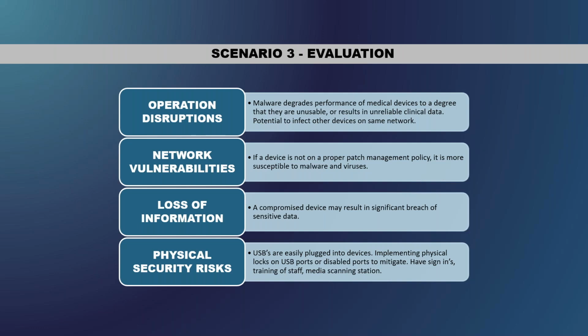So you also want to make sure that you have vendor check-ins in place, making sure that anybody who has access to it, also who's accessing all the medical equipment in your healthcare environment. And then also implementing those media scanning stations. Yep. So having those stations available in Biomed or in the records department, with antivirus scanning software that you can unplug from the network and it's still able to be used, and then scanning those devices, and then those are safe to be plugged into the device.